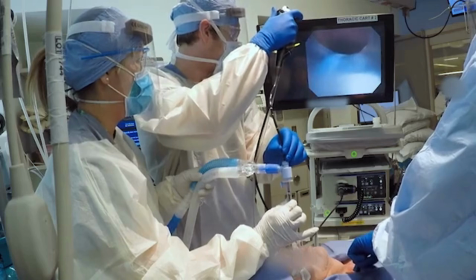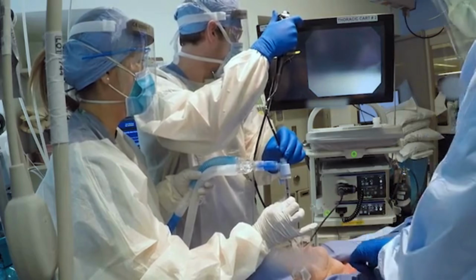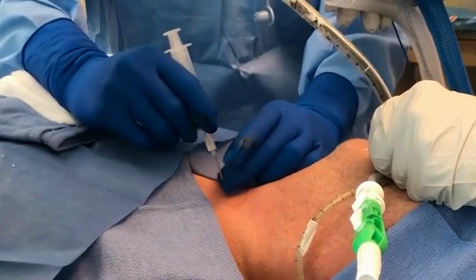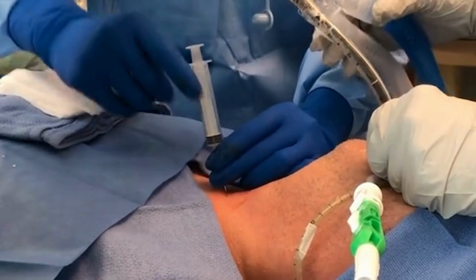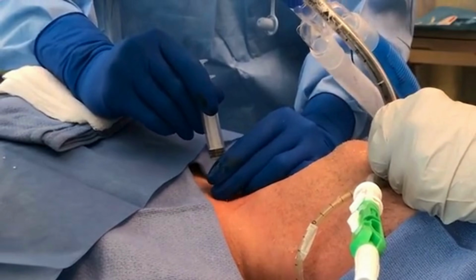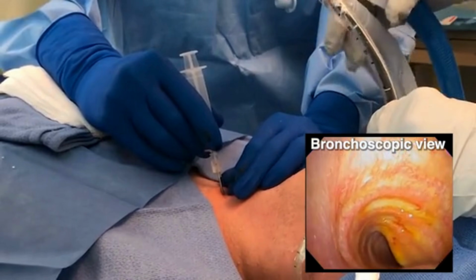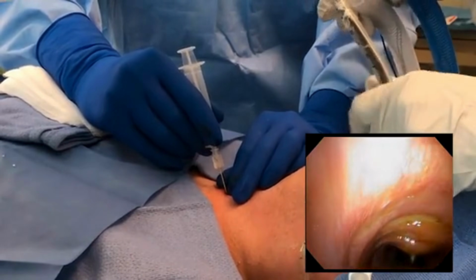Once the tube is withdrawn to the appropriate location, perform the tracheostomy using the Seldinger technique. Insert the introducer needle through the anterior tracheal wall under direct bronchoscopic visualization. Insert the needle around the second tracheal ring perpendicular to the trachea, with the bevel down. This bevel position helps direct the guide wire distally. Avoid damaging the oral endotracheal tube balloon.